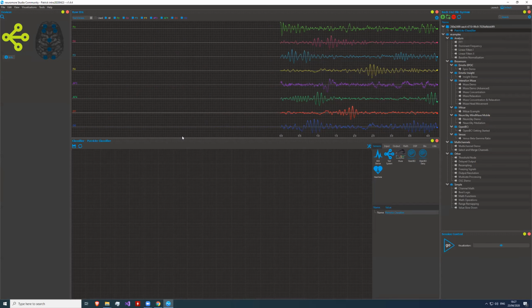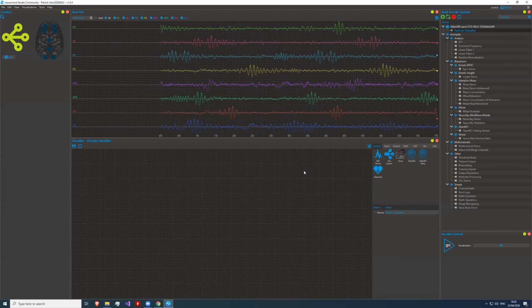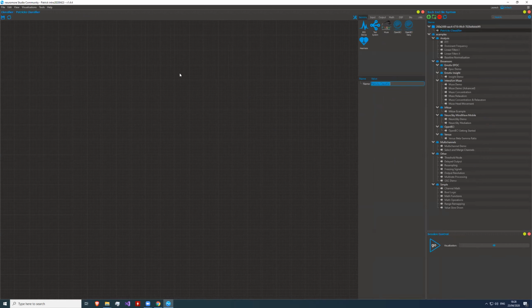Once you open it, you see that that particular classifier window now shows Patrick's classifier. And now we can get started. I'll just remove that for now. We don't need that, and we also remove that. Within the classifier, we have different tab panels for different nodes. We already mentioned the term node earlier.